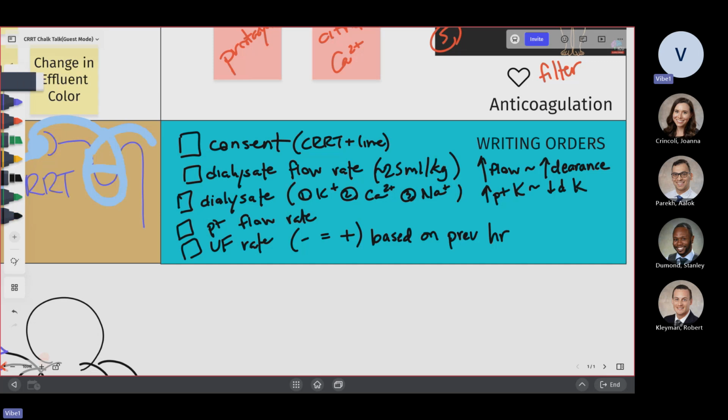So positive means, suppose a patient comes with rhabdo. Okay, a patient's creatinine is very high, patient is on pressors. You want to do dialysis, so you started the patient on CRRT, but you want to give the patient fluids. So technically, there is no role of giving fluids on the CRRT machine. What you can actually tell the nurses is, just keep the patient positive by 100 cc.